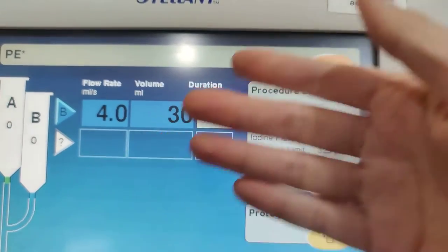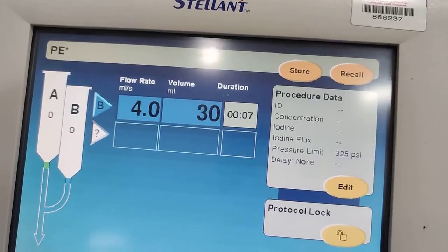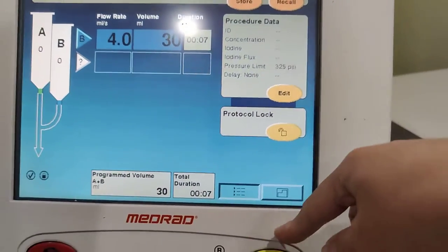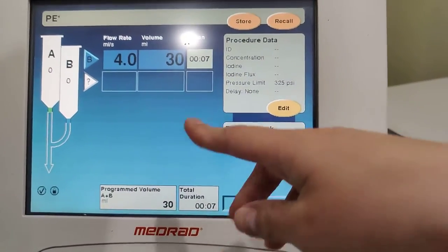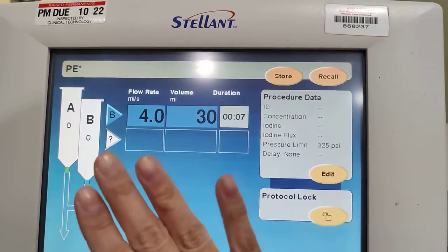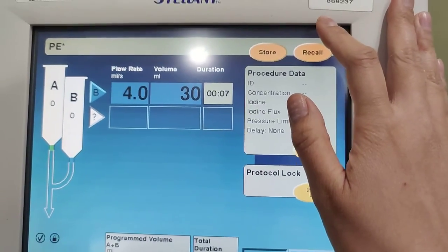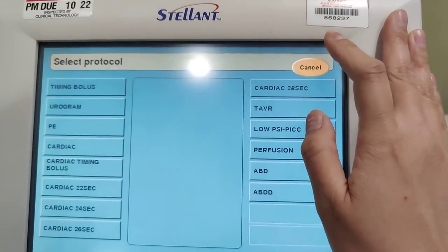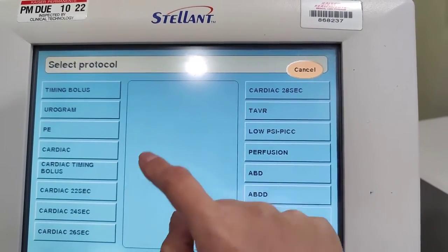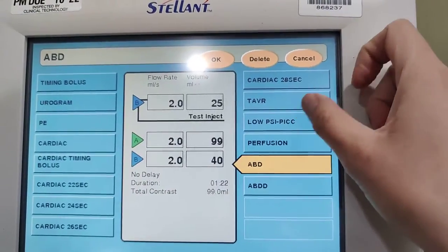Because contrast is thick, you want to clean the IV line with saline so you can reuse the IV later. Flush it through so you can still work with the line, then arm it and disconnect. That's how you handle a PE study, angio study, or CTA.